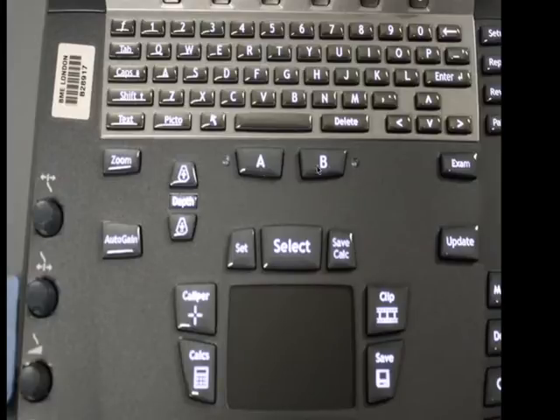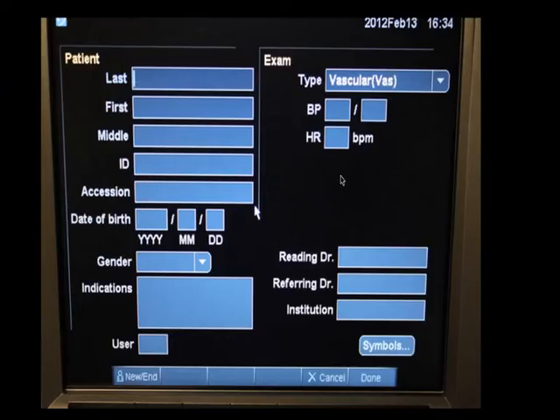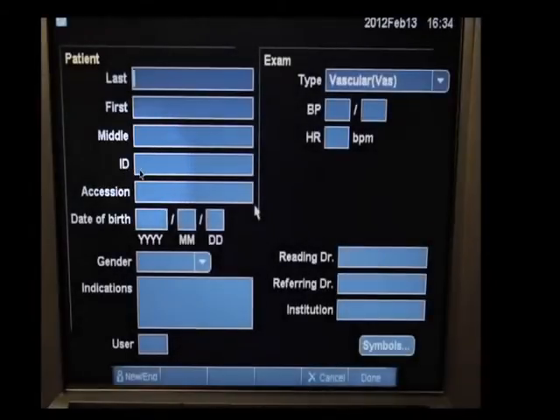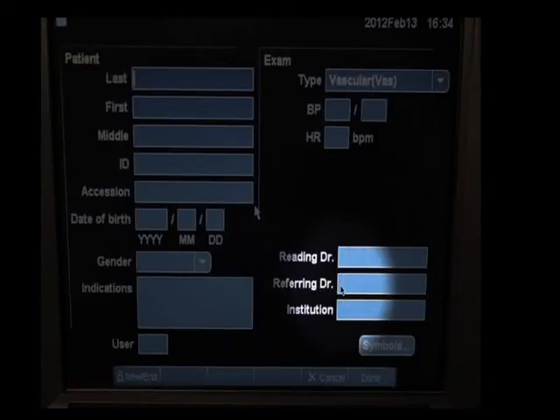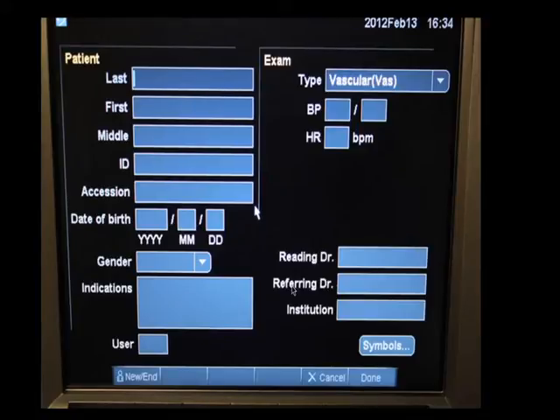You'll see on the dashboard there's an A and a B button. Both of them create the same function — to open or close a patient encounter. To open a patient encounter, you press either the A or the B button. This will bring up a screen of patient demographic information which at first glance looks a bit overwhelming, but you just have to put in the patient's PIN number in the ID field here. You can either press tab to navigate down to it or use the trackpad. Then your name — the scanner — goes in the referring doctor field. It's not actually your name but your Cerner login, typically your last name or the first seven letters of your last name followed by your first initial, and that goes in the referring doctor field, not the reading doctor field.